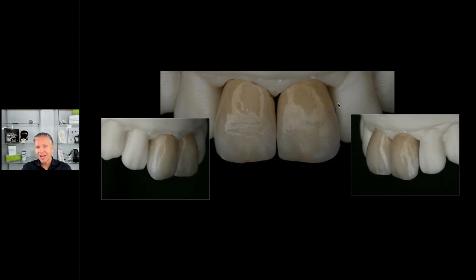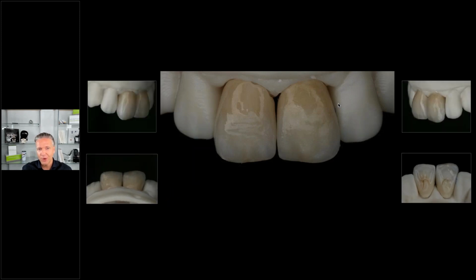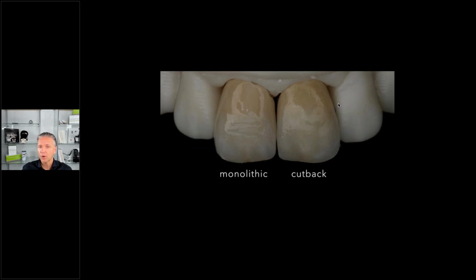So I'll usually ask, what do you think? Is the layered? What is the monolithic crown? I'll just show the slides here through, and it will show you which one is layered, which one is monolithic. So number 8 is monolithic, and number 9 is the cutback crown with layered porcelain. It doesn't matter the material. It's just amazing nowadays what we're able to do with our progressive modern high-end materials to be almost as close as a layered crown with a monolithic material.